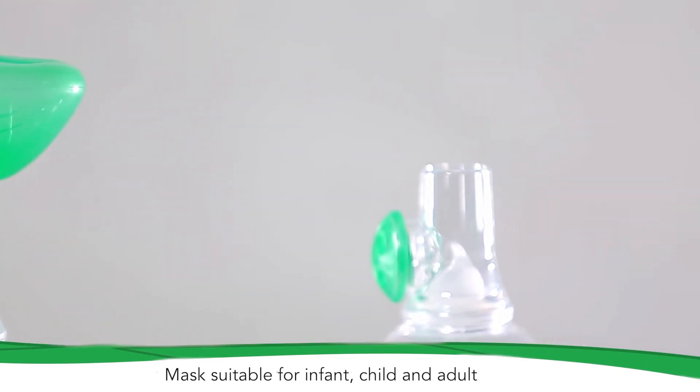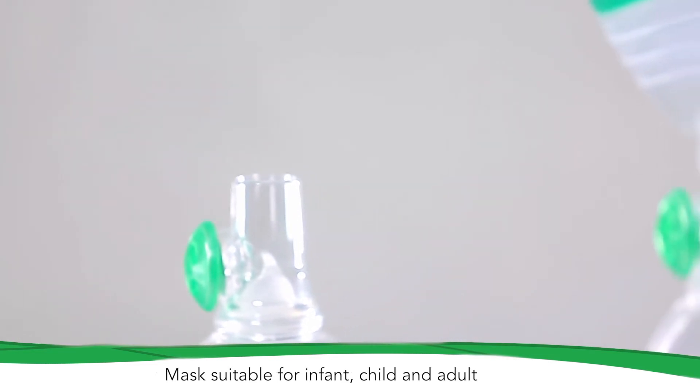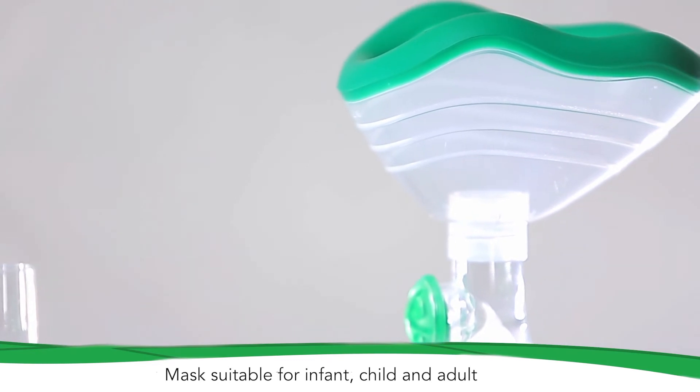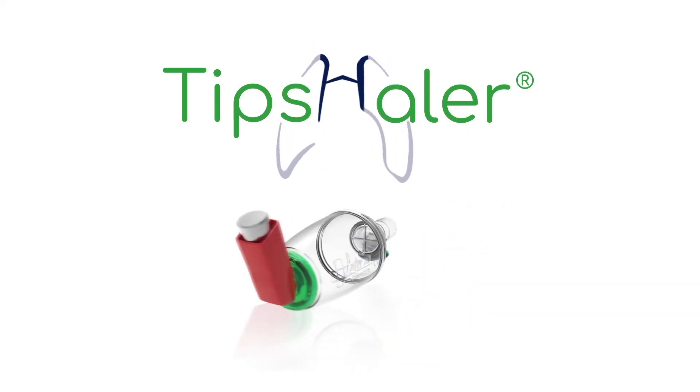Your doctor prescribed a chamber adapted to your medical treatment. This valve holding chamber is part of your treatment. Make sure to use Tipshaler as recommended by your healthcare professional.